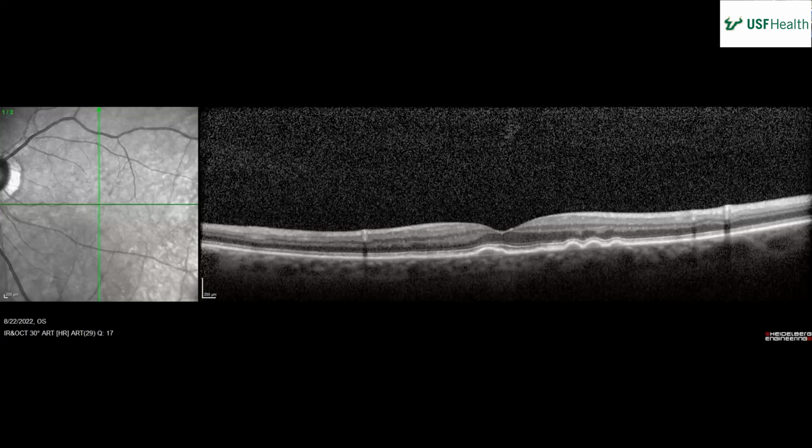I'm blanking, from the choriocapillaris, what are the layers of Bruch's membrane? You've got your... but then what's the other one on the outside? The basement membrane. Yeah, so you can see the basement membrane of the choriocapillaris there, part of this sort of splitting Bruch's membrane. Super, thank you.